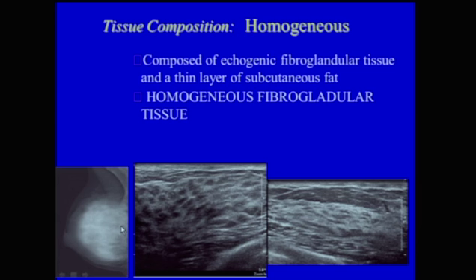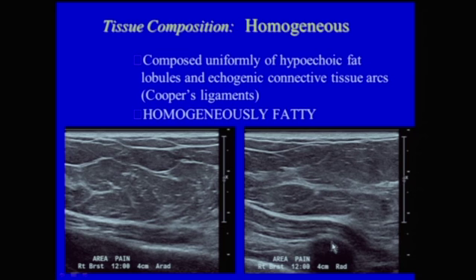Ultrasound can also determine the tissue composition of the breast. Here you can see a mediolateral projection of a mammogram showing a very dense breast, correlating with the adjacent ultrasound in perpendicular projections. The skin layer is seen through echogenic lines separated by a hypoechoic area, beneath that is subcutaneous fat, and then very echogenic tissue with tubular hypoechoic structures representing ducts. This is a typical case of homogeneous fibroglandular tissue. The breast could also be homogeneously fat, composed uniformly of hypoechoic fat lobules and echogenic tissue arcs, which are the Cooper's ligaments.